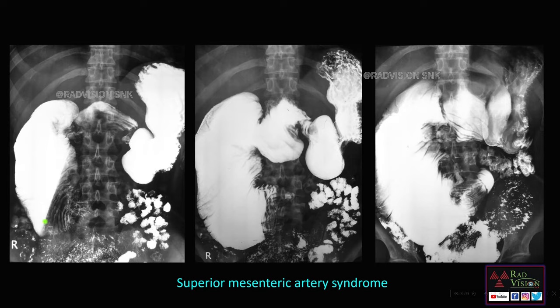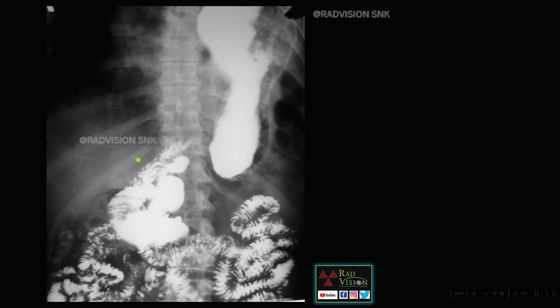Here you can see an abrupt cutoff at the level of the second part of the duodenum, with contrast not seen beyond the third and fourth parts. However, with change of position to prone and lateral positions, contrast slowly passes into the third and fourth parts of the duodenum. Whenever you see abrupt cutoff at the second part of the duodenum as a band, suspect superior mesenteric artery syndrome — compression of the duodenum between the acute angle of the SMA and the aorta.